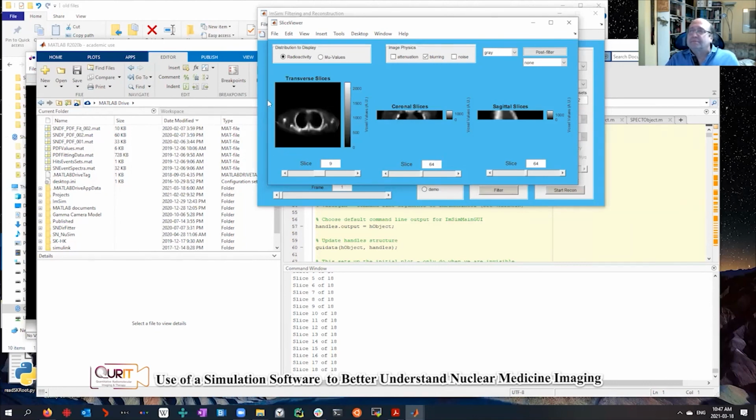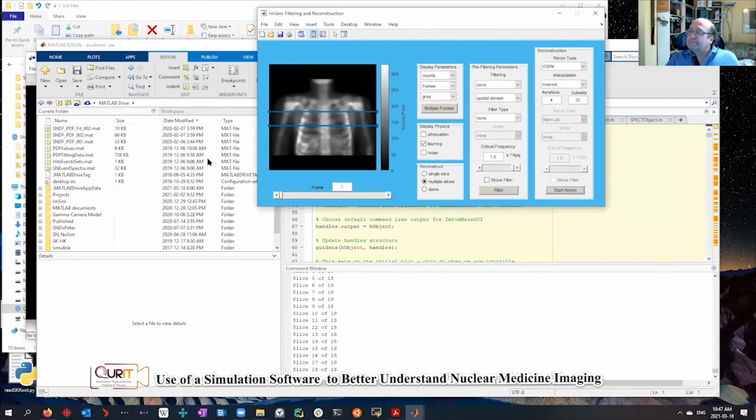That's amazing. Thank you. Questions? Any questions? Obviously people are very impressed by this software, and we're very glad that we had your session after we talked about image reconstruction, because now we're getting intimate with the sinograms and the images, and the theory is now coming into practice and into actual individual reconstructed slices. So it's very good. Thank you very much.